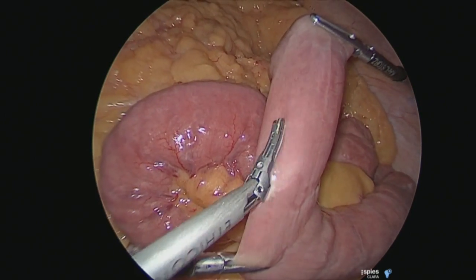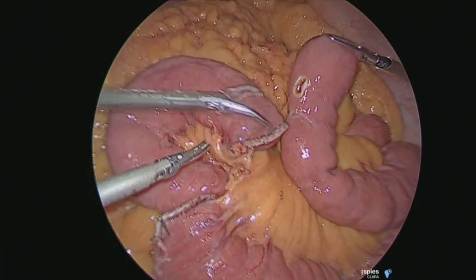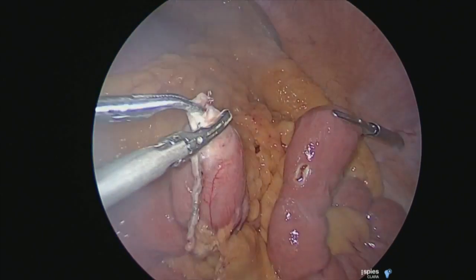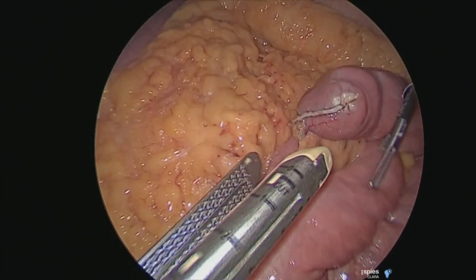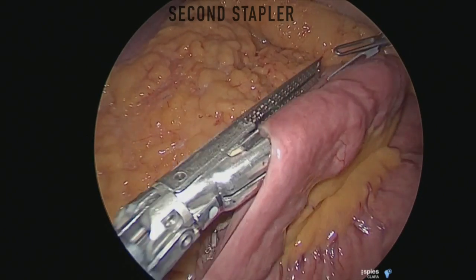I then measure a distance of around 75 centimeters to prevent reflux of bile and make a small little window in the anti-mesenteric border. You also make a small little window in the biliopancreatic limb to do a side-to-side jejunojejunostomy with a 60 centimeter stapler.